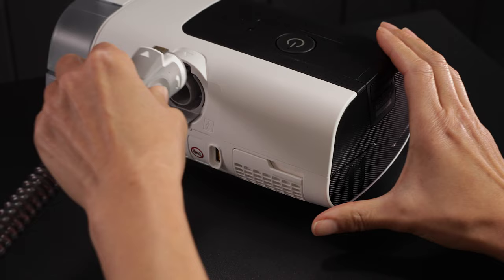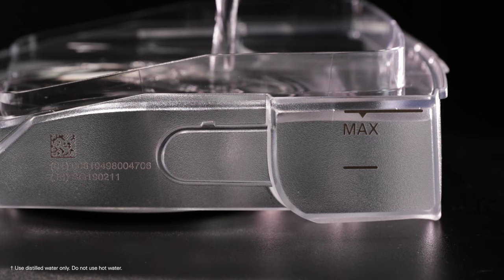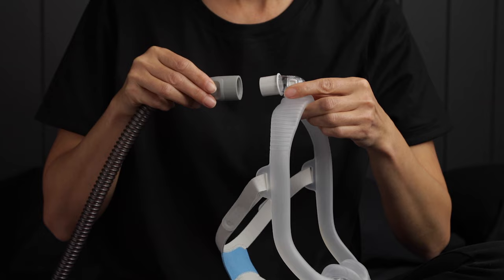Connect the air tubing firmly to the air outlet located on the rear of the device. Open the humidifier tub and fill it with distilled water under room temperature up to the maximum water level mark. Close the humidifier tub and insert it in the side of the device. Connect the free end of the air tubing firmly onto the assembled mask.